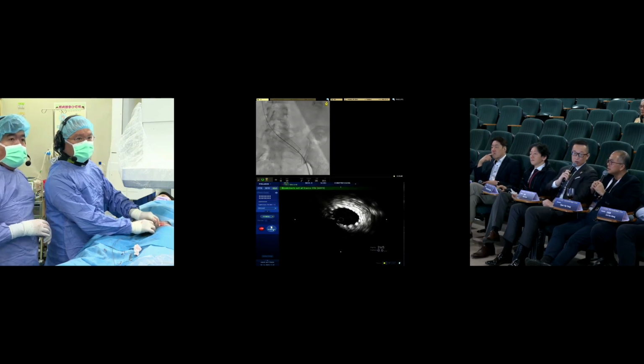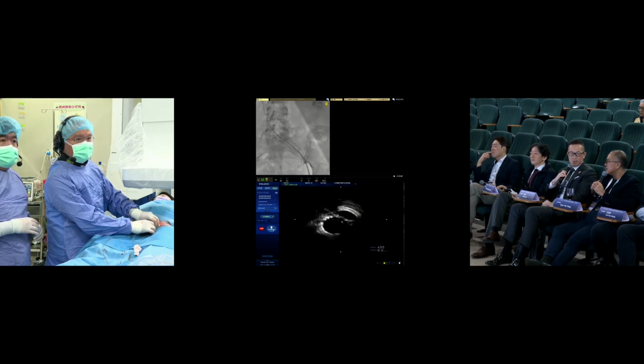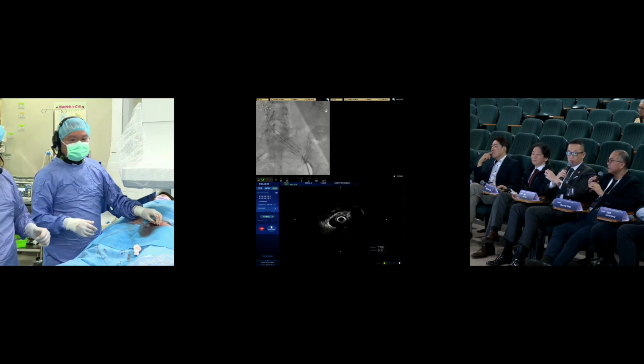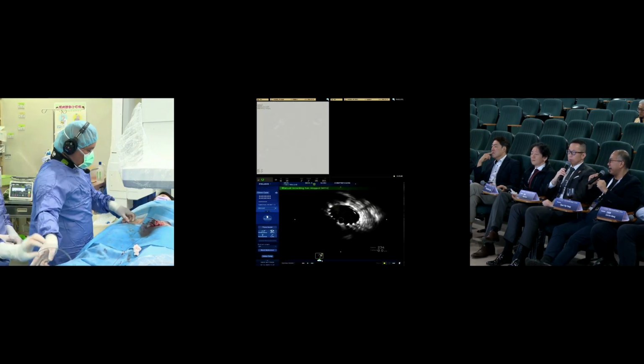Oh good. Do you think roundness of the venous stent is very important, or not a very important issue? Roundness of a stent after stenting, because sometimes the stent may be oval, not so round. I think that's where your post-dilatation comes into play. I think you do need it.